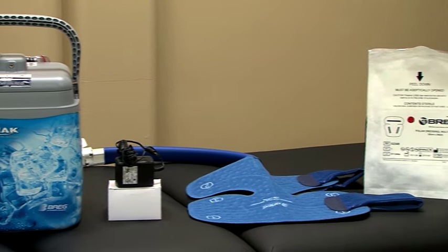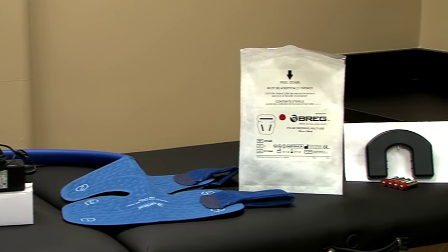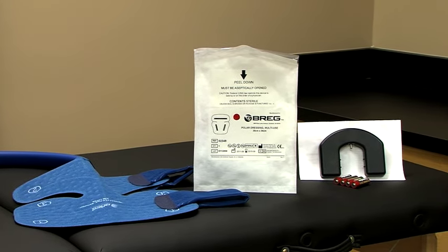The PolarCare Kodiak consists of four parts: the unit, the power supply, the pad, and the insulation barrier. There is also an optional battery pack.